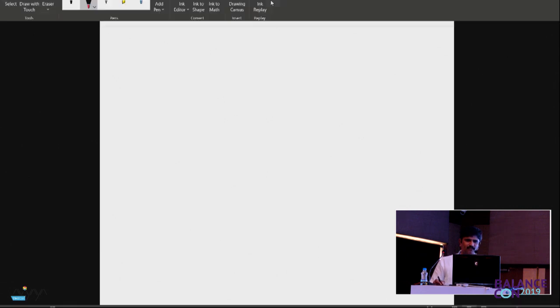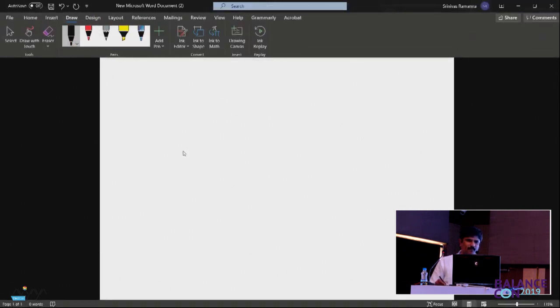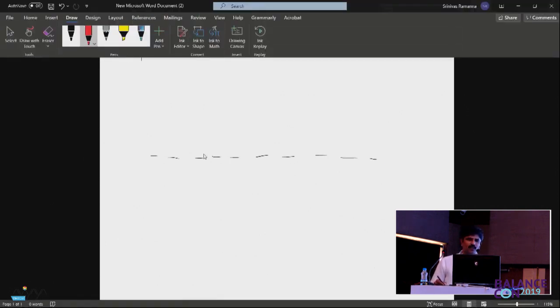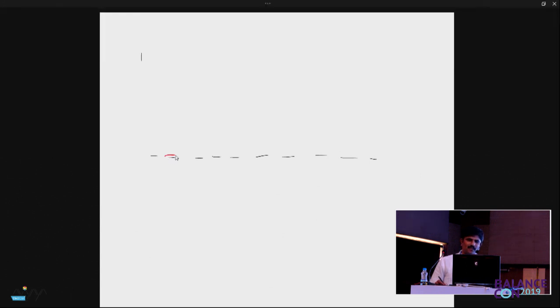Now, if this is the point of fixation, I'll write a dashed line to represent it. If the eye is fixing on this, suddenly it makes one jump of around 2 degrees to the right, then it is there for around 200 milliseconds or less, and then it comes back.